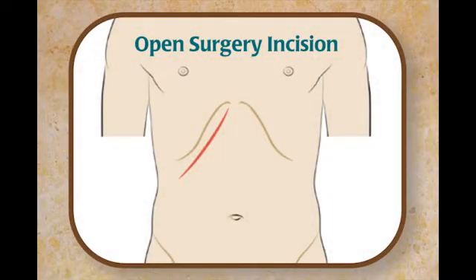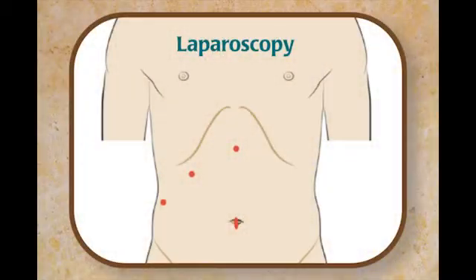Traditionally, the gallbladder was removed in the old days through a right upper quadrant incision underneath the ribs on the right side. It was quite painful. It was a muscle splitting incision. In the mid-'80s, laparoscopic surgery came to the forefront, and laparoscopic surgery's advantages were and are that a minimally invasive approach could be applied to the same disease process, whereby several small incisions can be made and working ports can be established, and it'll allow us to remove the gallbladder in a minimally invasive fashion.